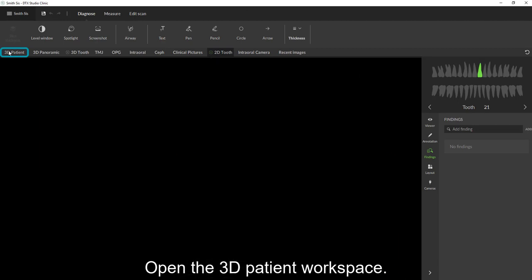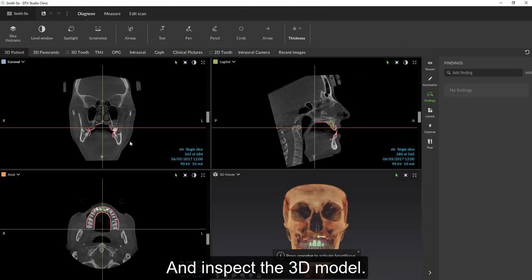Now we'll open the 3D patient workspace and click the 3D viewer to inspect the 3D model.